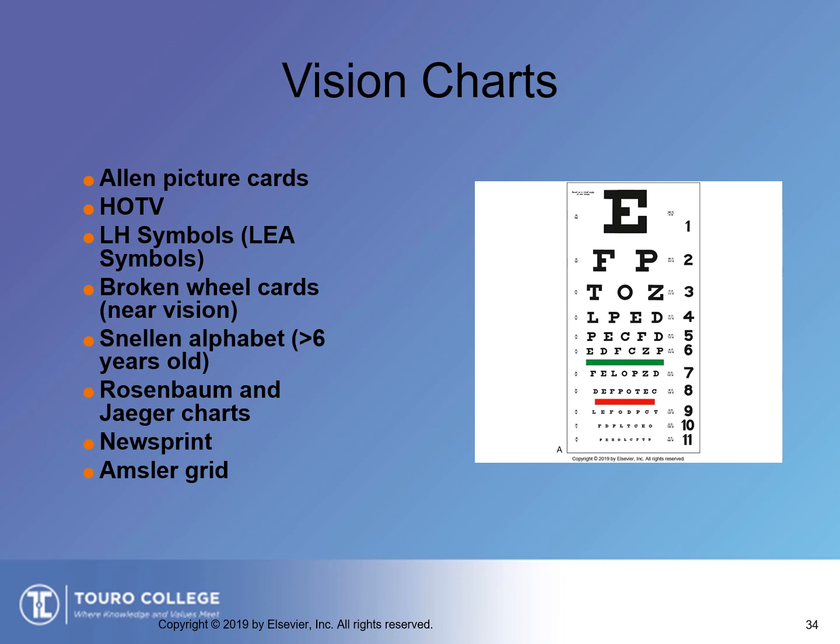Vision charts. This is the Snellen chart, and we use this in our physicals to identify vision problems. It doesn't replace going to the eye doctor, but it does help give us an idea. A big, important thing is that in order for a child to participate in sports, they have to have no less than 20/40 vision with glasses.